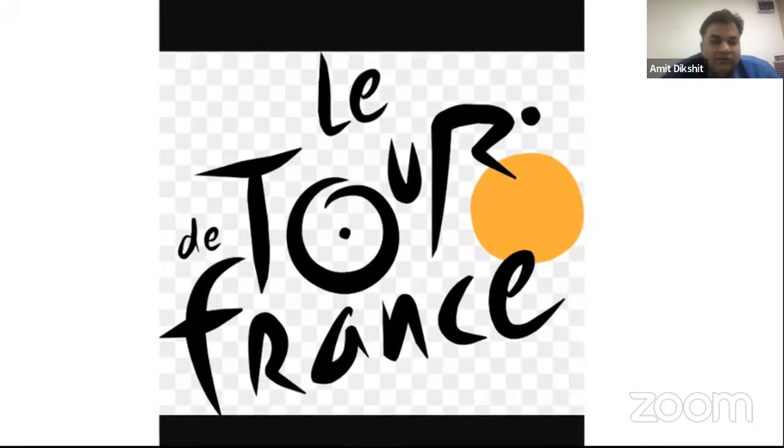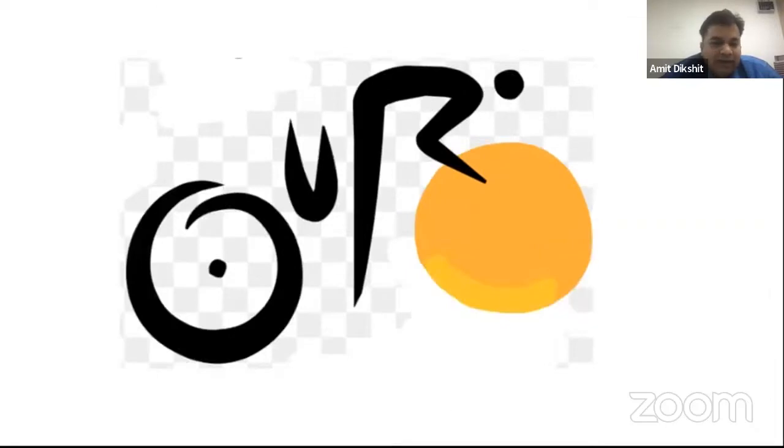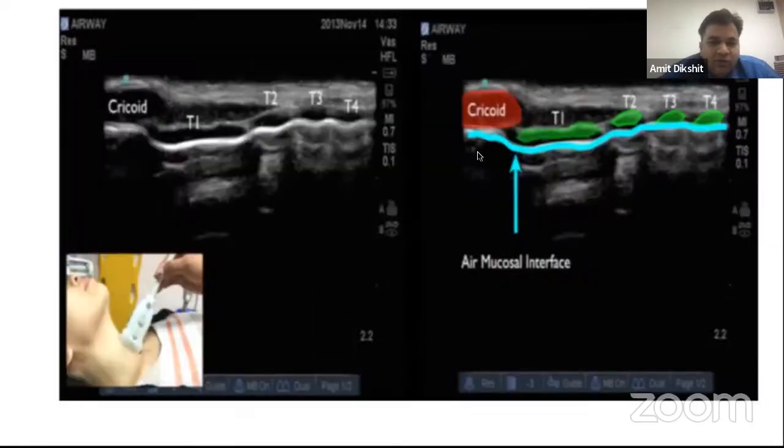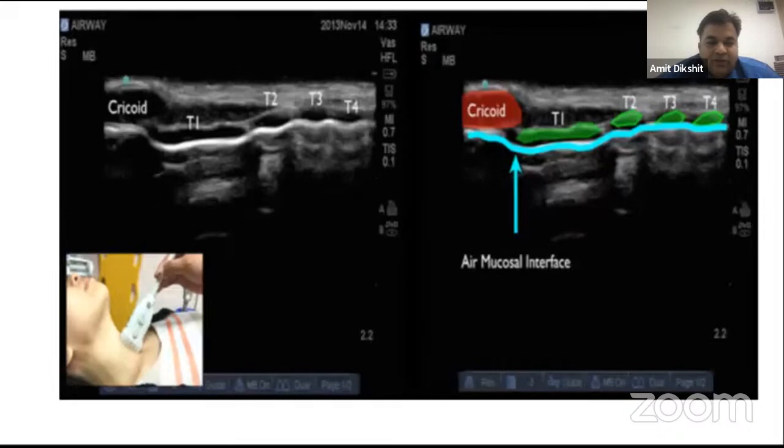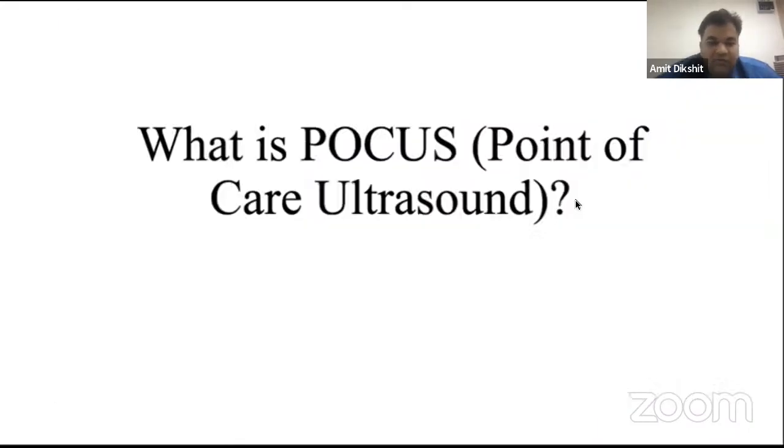So this is pattern recognition. So ultrasound training, when we look at ultrasound, we see some pattern. And when we know that, yes, these are tracheal rings, string of pearls, this is cricoid cartilage, and somebody is telling us, and then we start recognizing this pattern. And then we memorize this pattern and we try to correlate with our regular findings. So ultrasound training is basically pattern recognition. The more you are exposed to different patterns and you memorize them and you try to see the ideal pattern and see the variation, you'll pick up so many things.